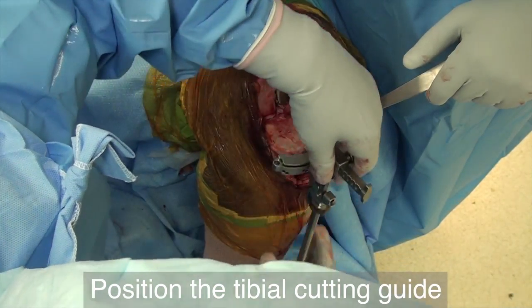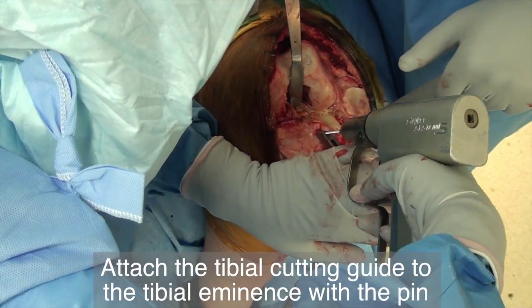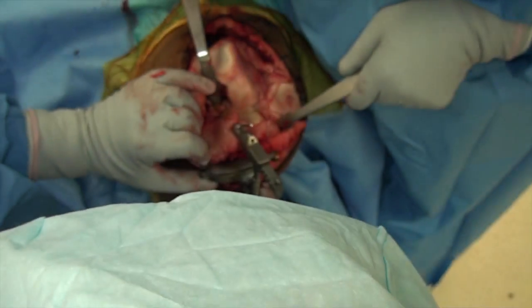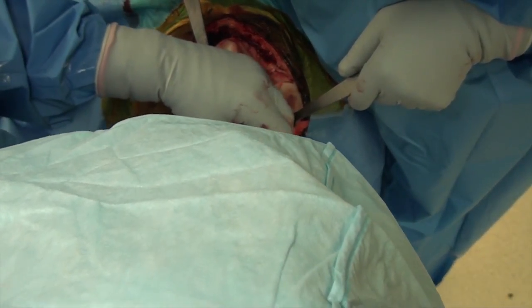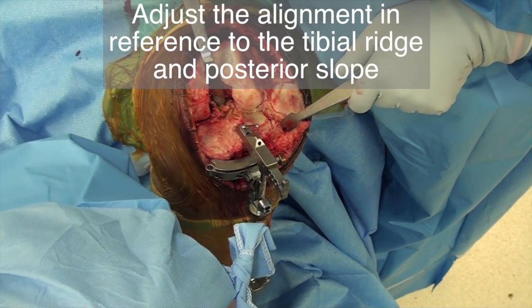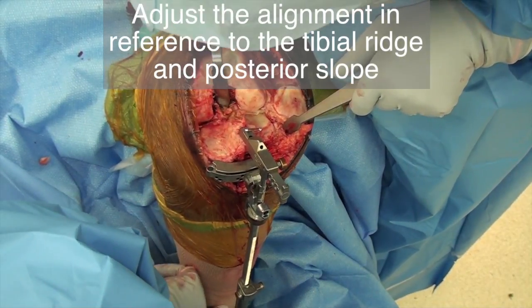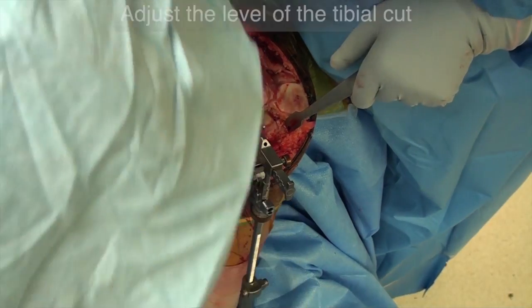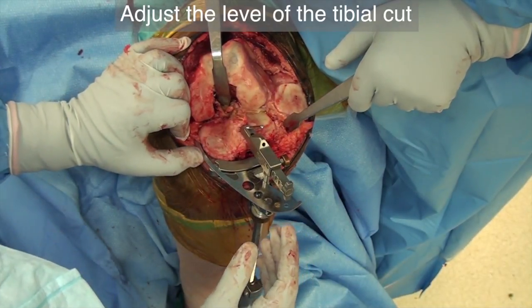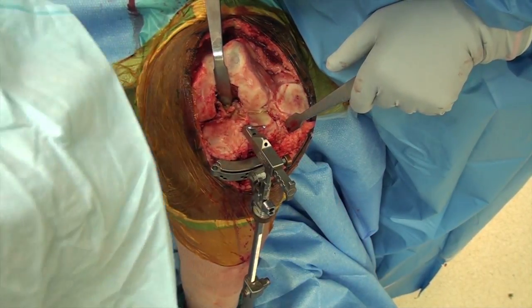Position the tibial cutting guide. Position the top part on the tibial eminence and secure it with a pin. Slide the cutting guide against the bone. Align the long part of the guide with the tibial spine to ensure the horizontal cut, and position it two fingers away from the bone at the level of the ankle joint to ensure the posterior slope. Use the angel wing to establish the thickness of the cut. Once the cutting guide is properly positioned, secure it with pins.